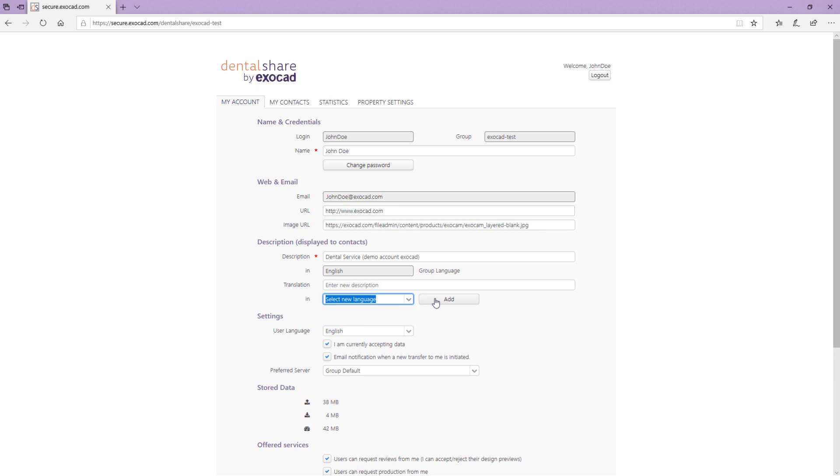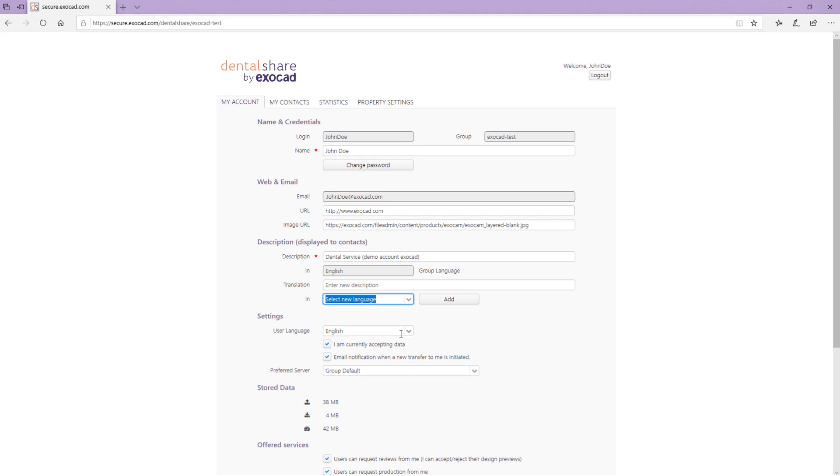You can set your user language in the corresponding drop-down menu. If you are currently not accepting data from other users, uncheck I am currently accepting data. If you do not want to receive notifications via email when data is being uploaded to your account, deactivate email notification when a new transfer to me is initiated.